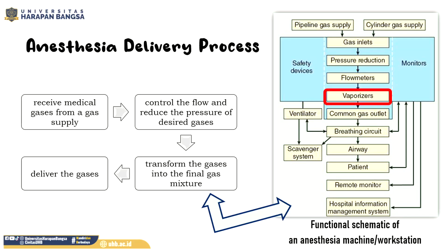And then it transforms the gases into the final gas mixture through the vaporizers, and next delivers the gases at the common gas outlet to the breathing circuit connected to the patient's airway.